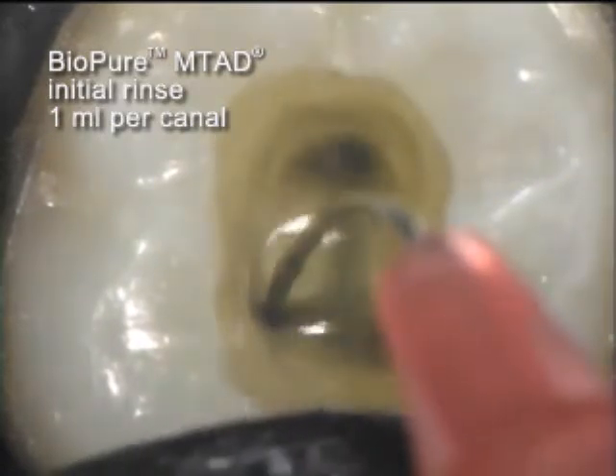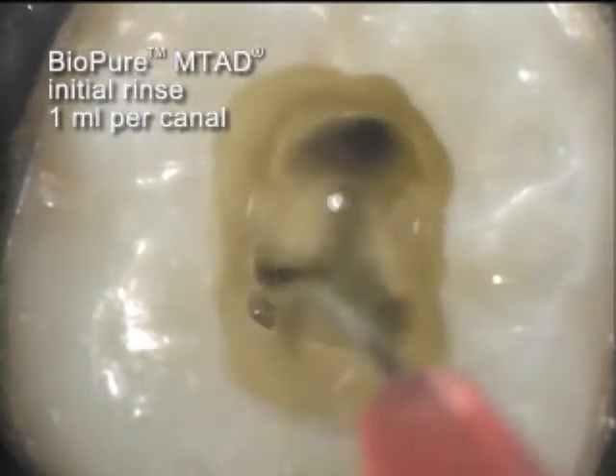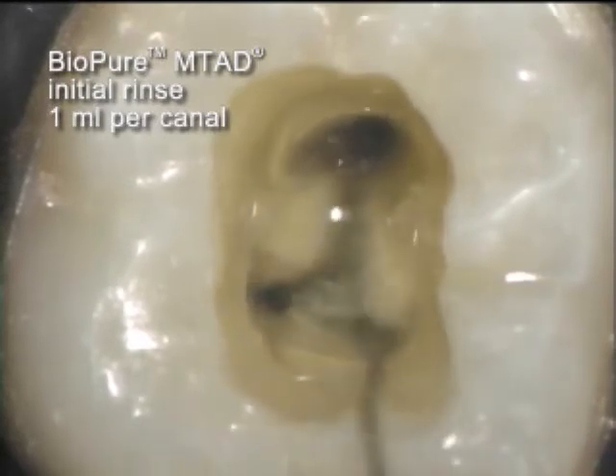A 28-gauge side-vented needle is utilized to get one milliliter into each canal for the initial soak.